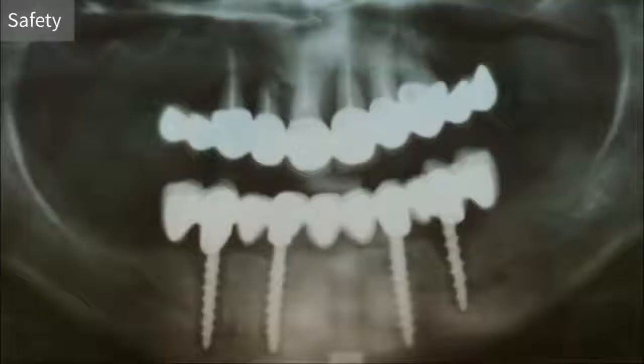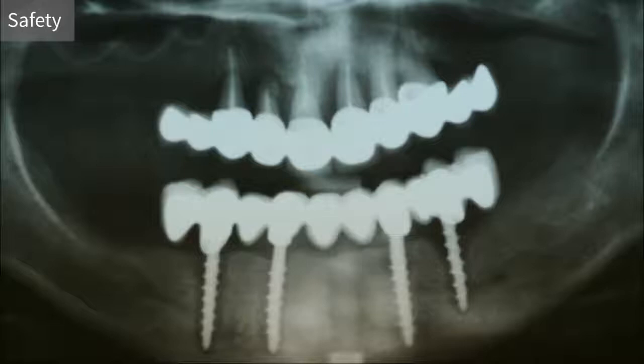But of course, we also met more seriously problematic situations, like on this picture, where the nerve is damaged by the drills and by the implants. Of course, these situations require a lot of handling, not only treatment-wise but psychologically. So these are extremely hard situations to handle, since the patients are ending up with lifelong disabilities.